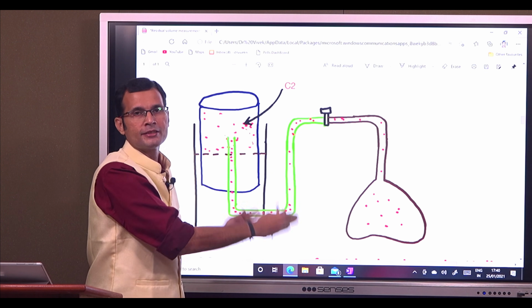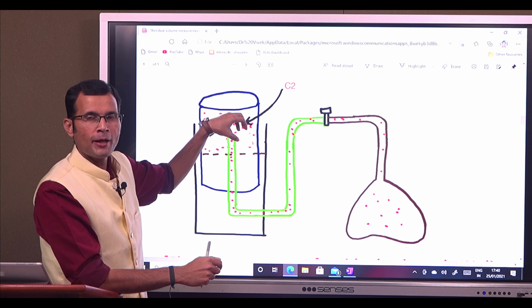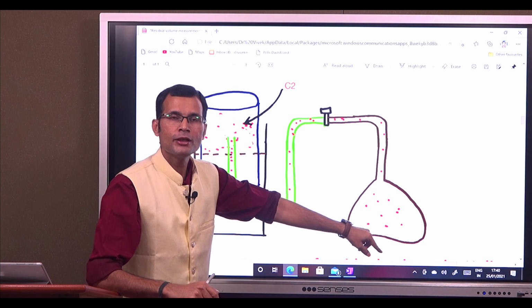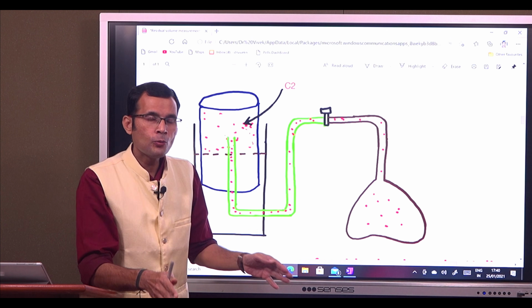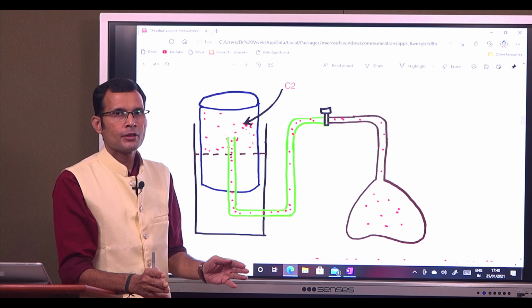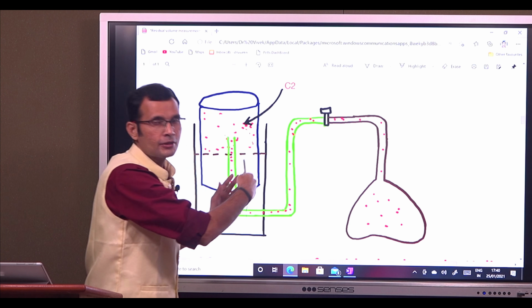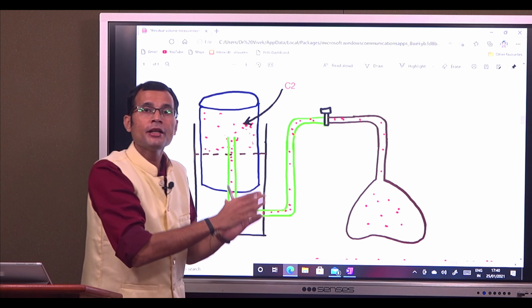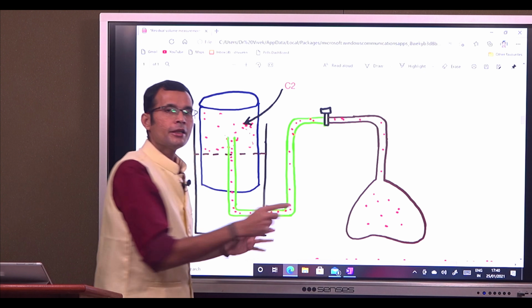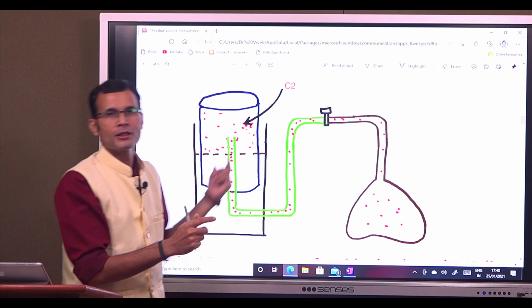Remember that it's one system now, from the moment the valve was opened, and the helium that was placed into the spirometer flows through this tubing and enters the lung. So C2 is the final helium concentration, after the helium has been dispersed and distributed evenly into the compartment, which includes lung volume plus spirometer volume.